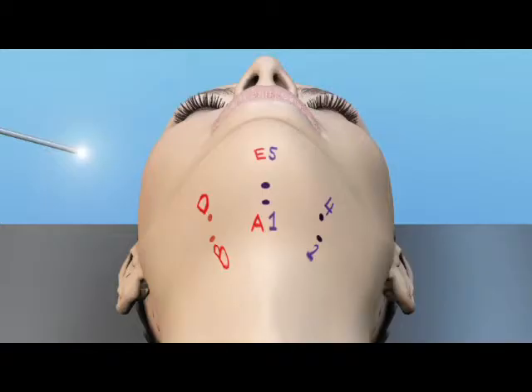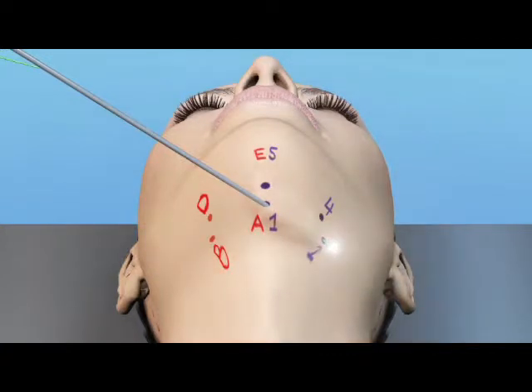The suture rod is then activated by attaching the light source. The illuminated tip is then inserted in the midline puncture marked with 1, and it's carefully threaded to the patient's left.